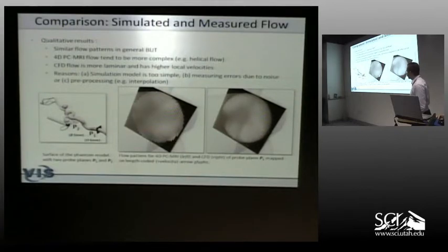What is quite typical in investigating such flow measurements is to take a few planes and to explore the flow at these planes. One plane was positioned at the inflow before the flow enters the aneurysm, and one at the outflow. And what you might imagine is the correspondence of the flow is better at the inflow plane compared to the outflow plane after many things happened. Here's a comparison of how this looked like with glyphs for this P1 plane.